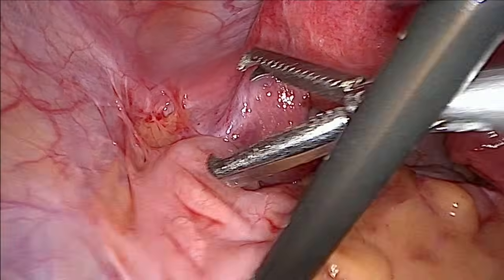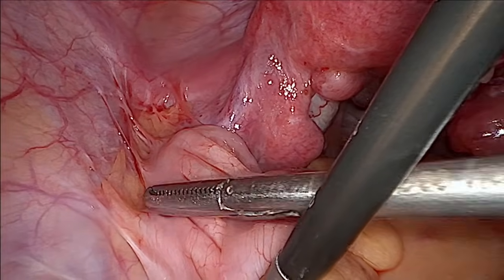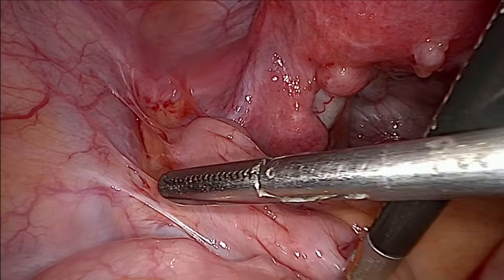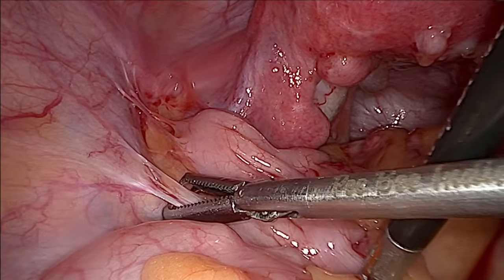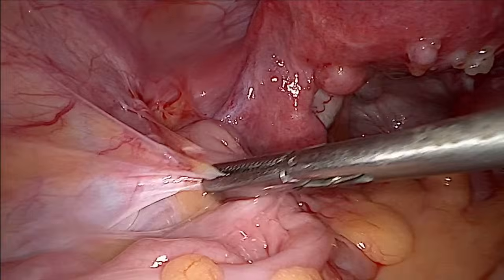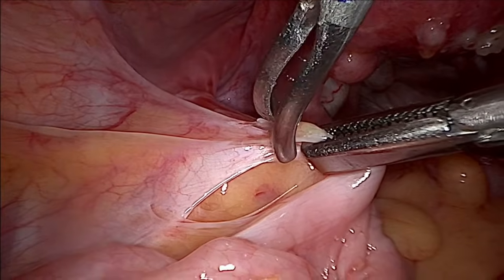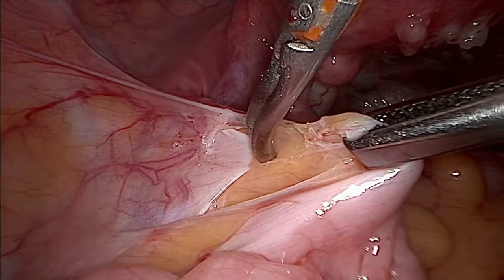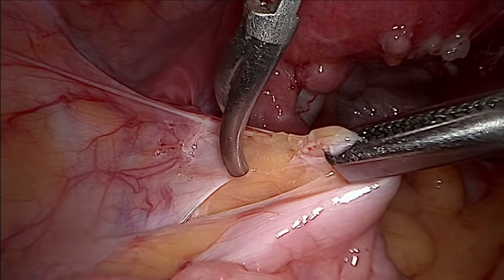We can see the serosa is very close here on the lateral pelvic wall. So what you can do is stretch and hold this part. No need to touch the serosa. You pull the fat here. Now you can see there is a difference, this and this. You just go in that line.